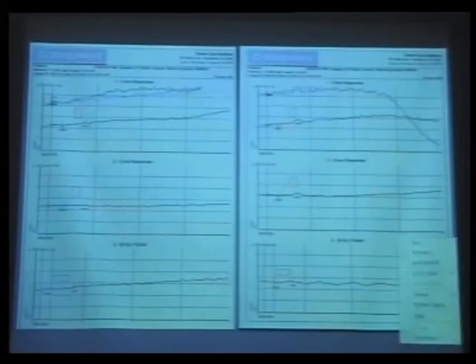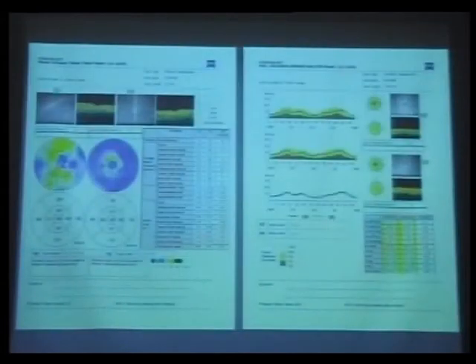And his cone response in each eye was really negligible to almost negligible. But he had some vague vision that was count fingers in a small island that he could see, and we were very interested in trying to maintain that for him. This was his scotopic response, which was really quite inapparent for us. And we did an OCT on him, and he had a tiny island of vision centrally, and the OCT seems to suggest that might be truly real. But it really shows quite a loss of his photoreceptor layer and loss of his retinal nerve fiber layer as well.